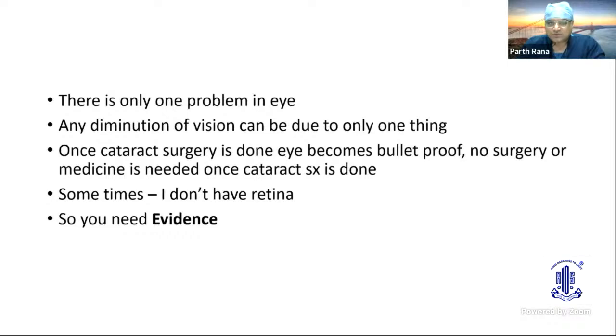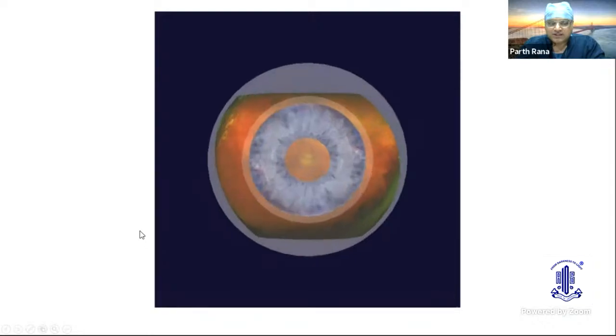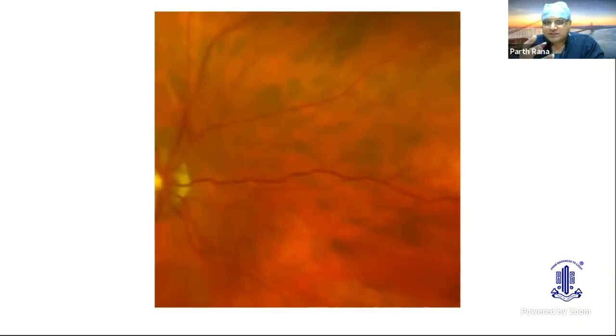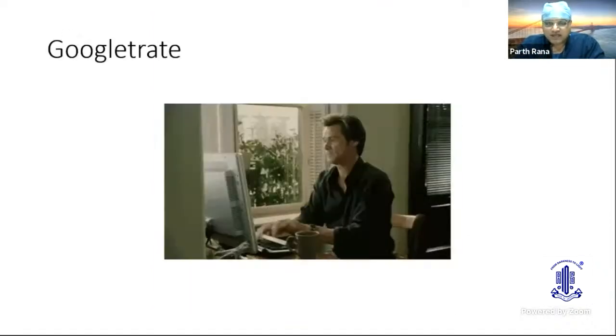So this Optos is giving us this evidence. When a patient comes to me, I show him this 3D wrap, which is already inbuilt in the Optos, so we can just show them. This is your retinal imaging, and as you can see, this part is inside your eye. It is on the backside of your eye. When we explain this, then the patient has a little bit of faith in the retina surgeon. Otherwise, they always feel, I have done my cataract surgery, why is something happening in my eye?